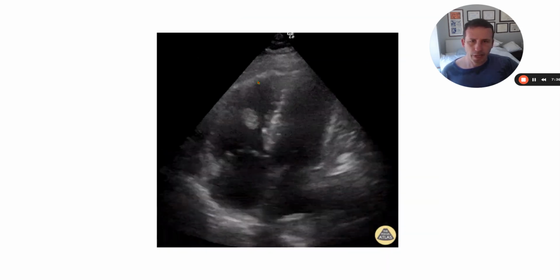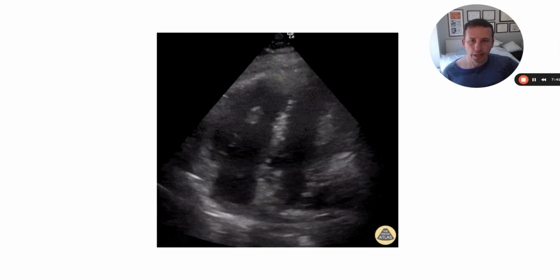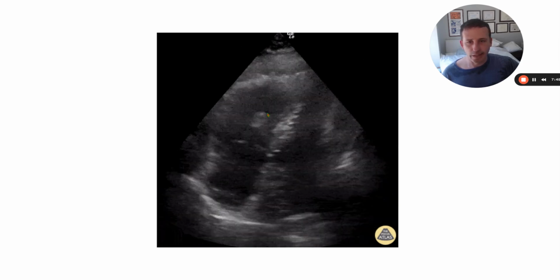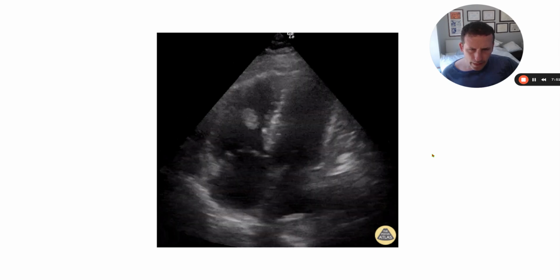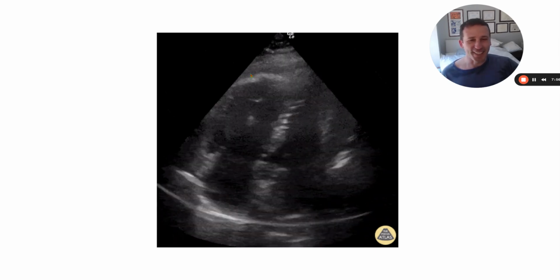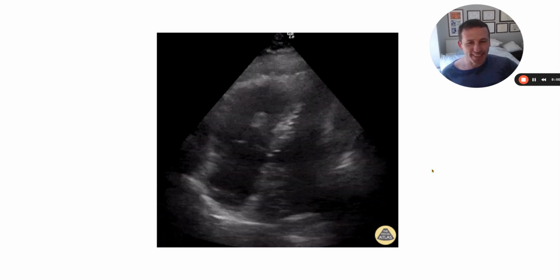Here's another example of McConnell's sign. You got this RV apex sort of bowing in. And then what you also see right here in the middle is very bad news. That's a free thrombus inside of that RV. So that should make everybody's sphincters pucker. That's pretty specific for a PE. You see McConnell's sign and a clot inside the RV. It's like, that's PE till proven otherwise.